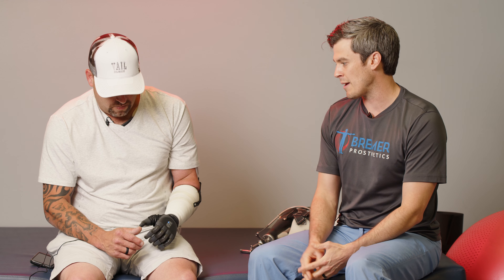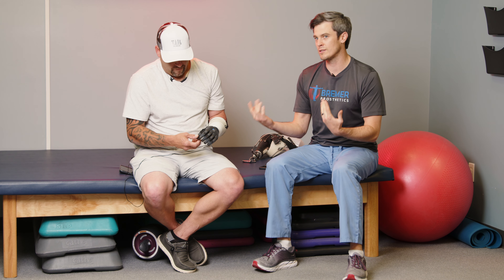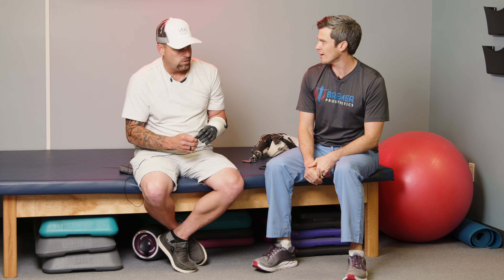So we did that. We built him a couple because he really is heavy duty. We're on the second body powered now. We started talking and I'm like, well, there's some new stuff that just came out that kind of is a game changer in terms of durability. There's finally a hand that has different grip patterns and all those things that is made to be robust, made for people doing construction or heavy duty work. And so he was interested. That's pretty much how we got here.